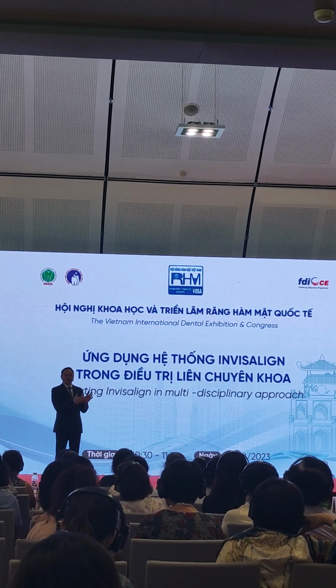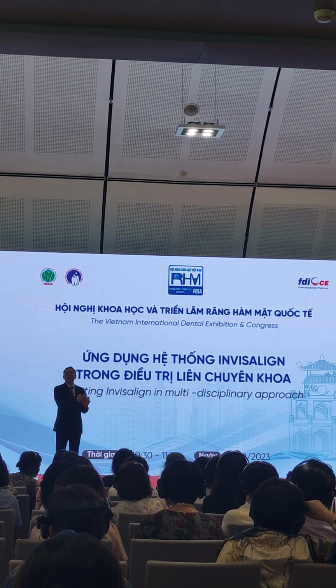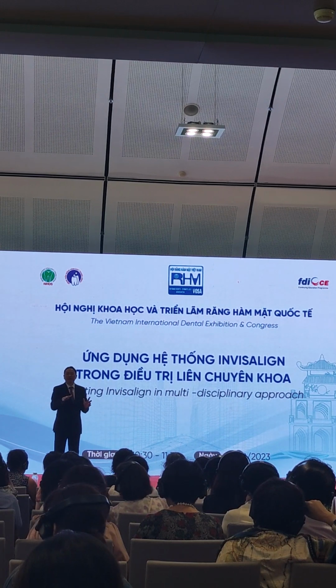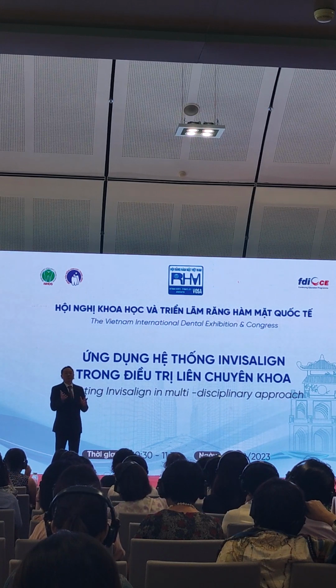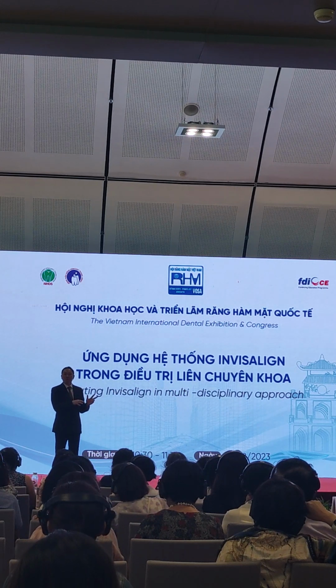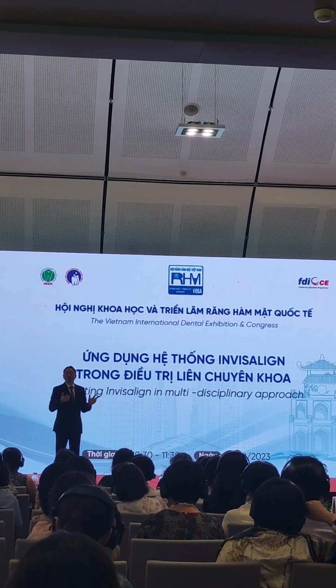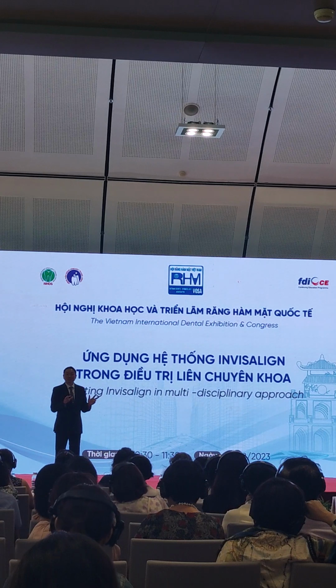And also with elastics, we can run strong elastics, because in conventional braces we use very light elastics, 3.5 ounce or 4.5 ounce is already sometimes too large. But with an aligner, because of its nature of preventing unwanted tooth movement or any unwanted extrusion, even running heavy elastics won't cause occlusal canting. So that's the reason we use strong elastics.